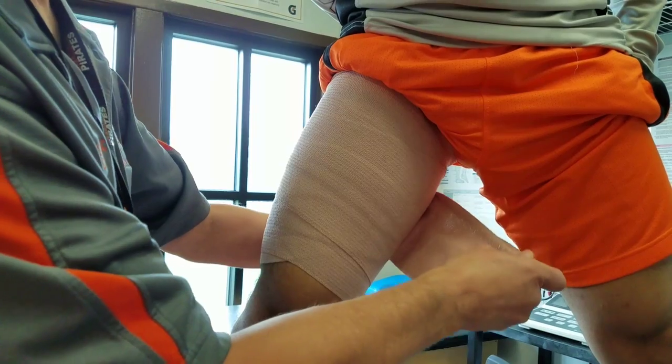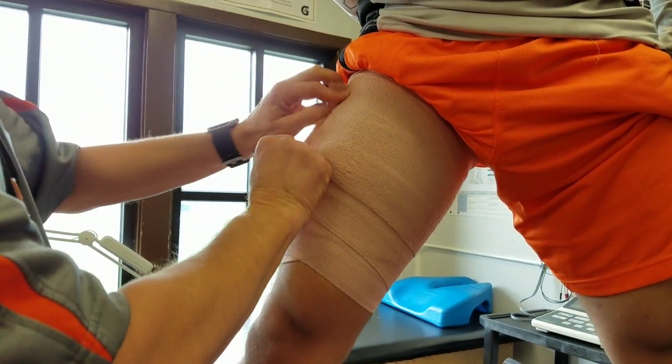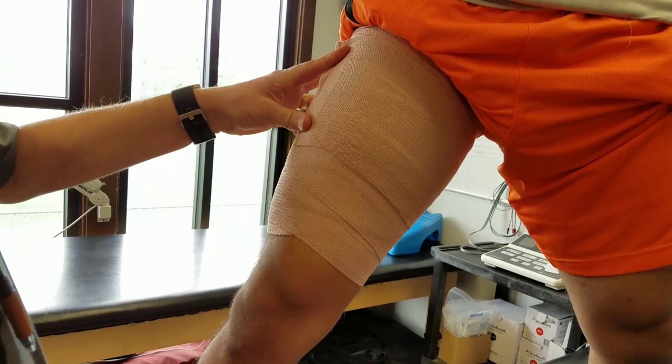There are traditional or regular size versus double-length ace wraps. Never end your ace wrap on the inside of the body part — the medial side — because it could fall off, especially if you don't secure it well.